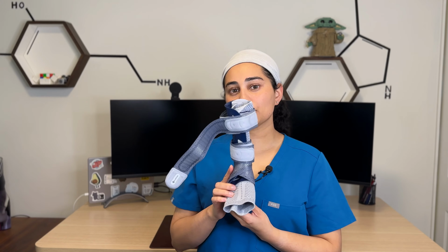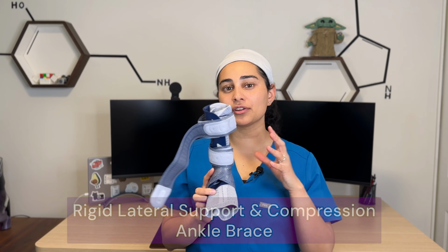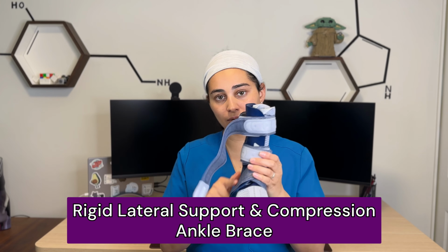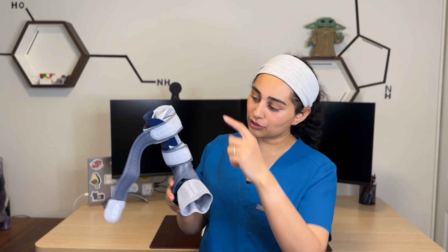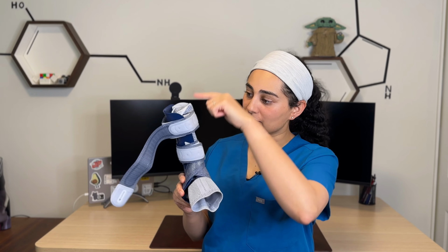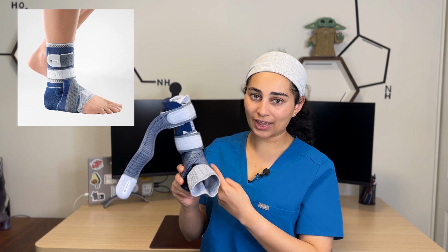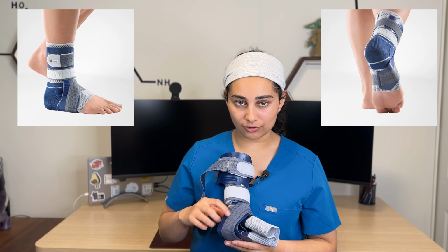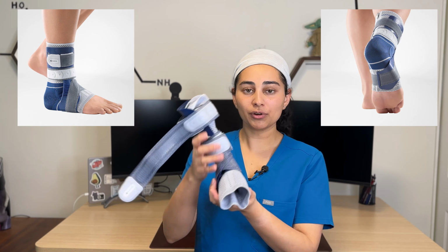So this here is very similar to a lace-up ankle brace, but it's very specific for a rigid lateral stabilizer. So this here will actually stabilize the lateral aspect of the ankle. As you can tell, there's that compression sleeve here. You slip your foot in there. You also have an added benefit of the strapping system, but this here is your rigid splint. So it prevents the ankle from twisting in. So as you can tell, I can't twist it in. You still can actually twist it out a little bit, but you can't roll it in.